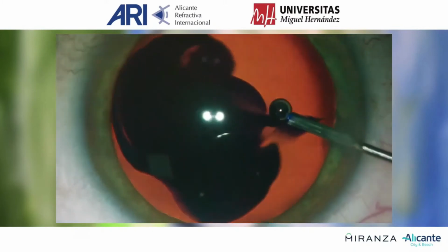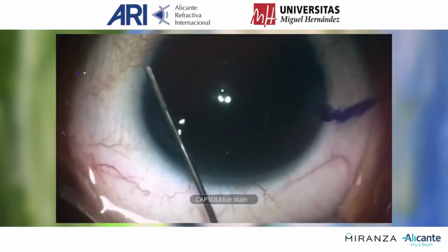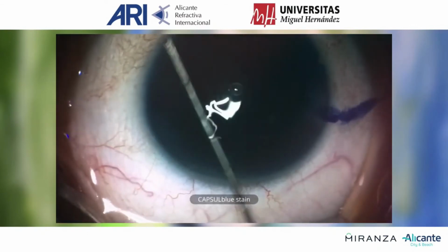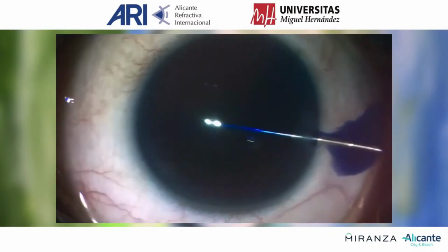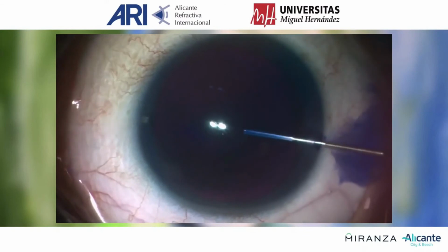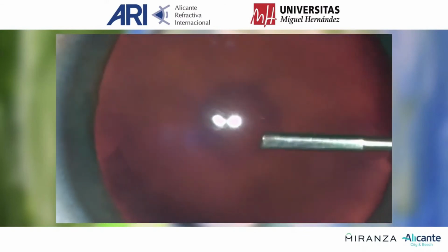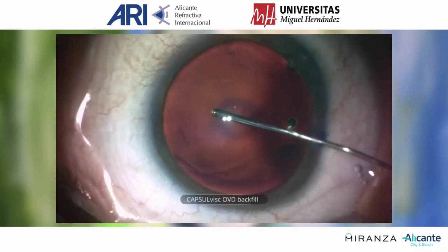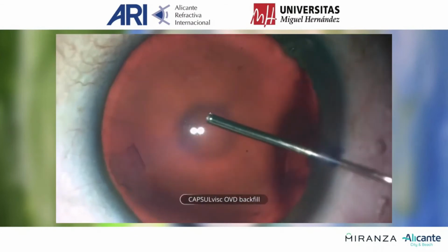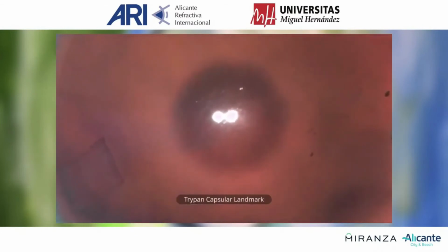The procedure begins with anterior capsule staining with proprietary trypan blue for 30 seconds. The dye is washed out by BSS or Ringer solution. And the anterior chamber is filled with OVD. The blue center is a landmark for capsulotomy centration.